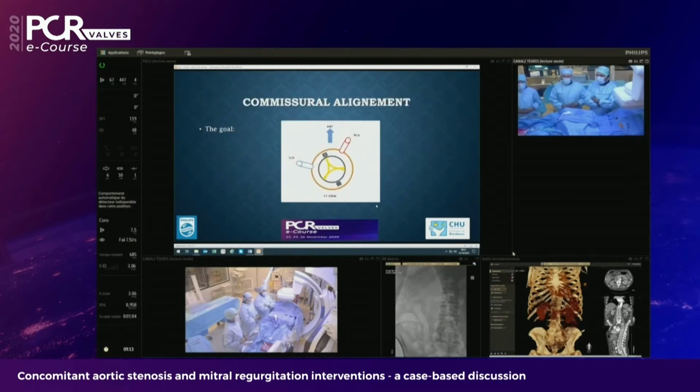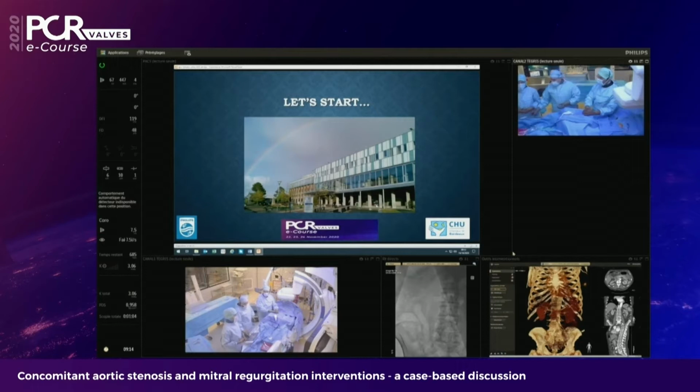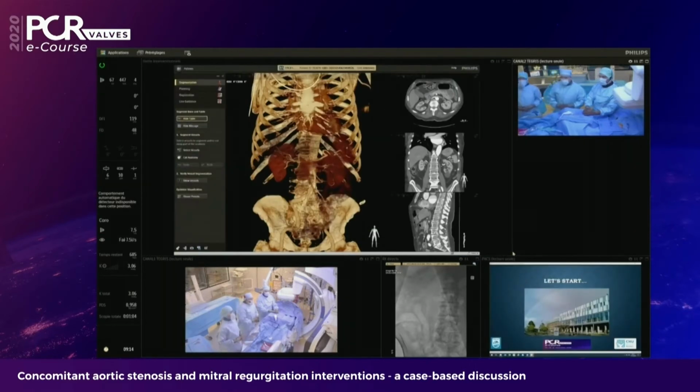Just this explanation to show you how a CoreValve is built. The CoreValve has two paddles and three posts. We want to deploy the anterior paddle, with the C of the CoreValve, in the anterior part of the patient, just between the right and the left coronary artery, because this paddle is just in front of a post. The other paddle without the C has to be positioned posteriorly, because we don't want a post of the stent just before the coronary ostia. And now we will show you how we can do the planning of the procedure for TAVR.